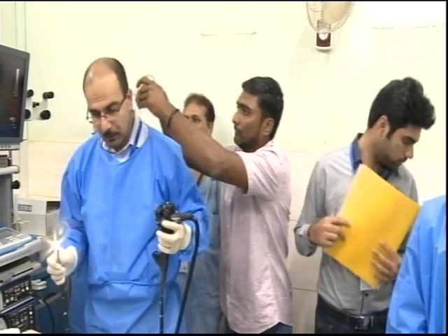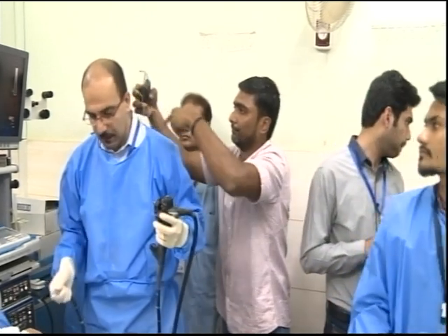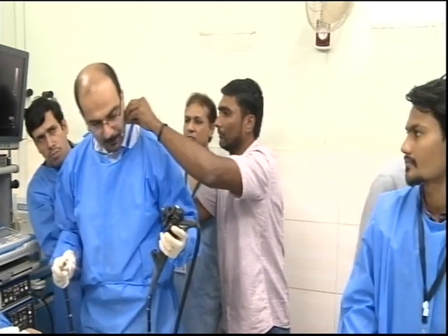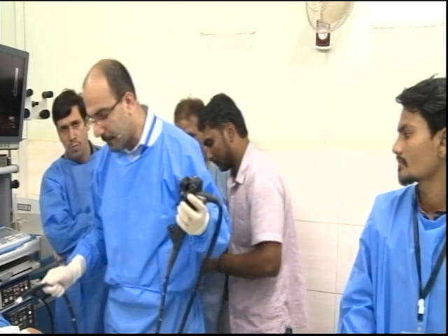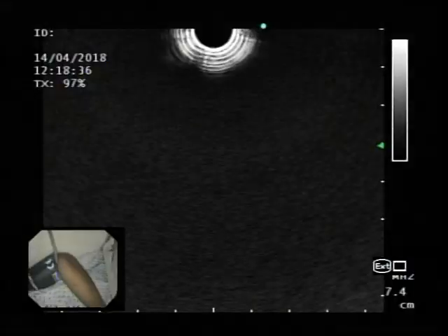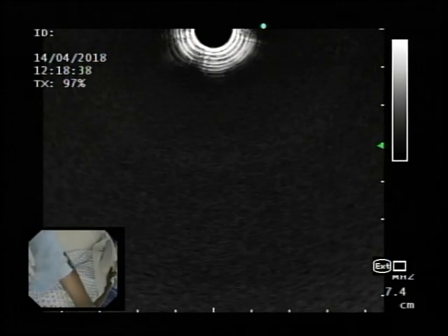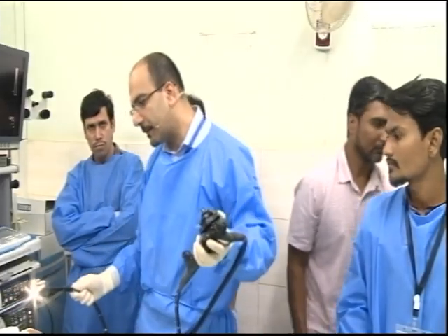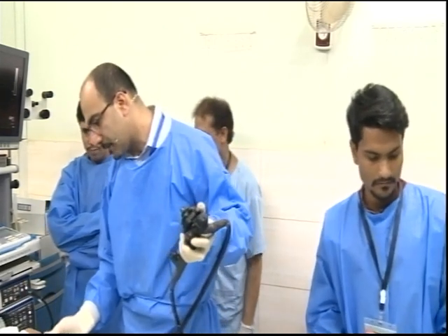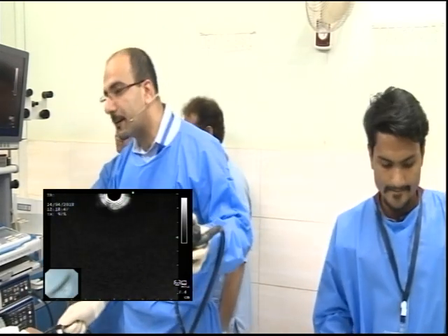Okay. So we've already tested the balloon. The patient's already sedated. While we were waiting, I was just checking with him. In the last month, he's had about 6 to 7 days of pain. He did lose weight, but has gained weight back, and he's steady, and he's describing greasy stools. So clearly he has pancreatic insufficiency.